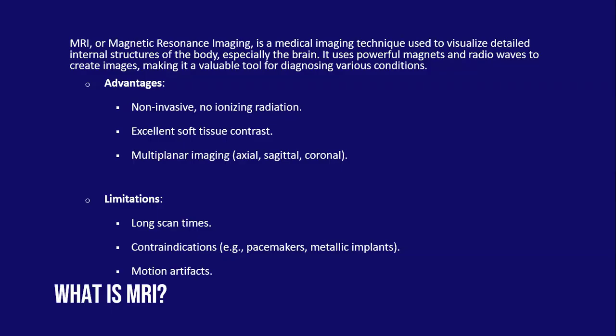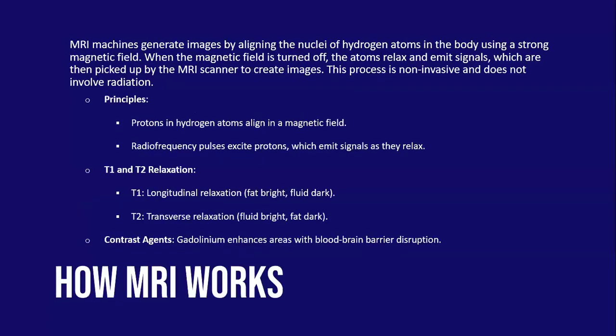The other thing, as a final limitation before I move to the next slide, is because of the MRI machine. I'm sure most of you must have seen it. If not, please just pay a visit down to the MRI scanner we have at KNH. You would see that some people have claustrophobia. So getting into that tight space for quite some bit of time, some patients would feel uncomfortable. So you would have to sedate them, etc., to be able to get imaging. Same for children, for them to stay still in that particular place for a very long time. You would see that they would be uncomfortable.